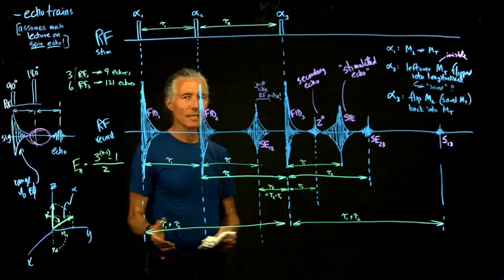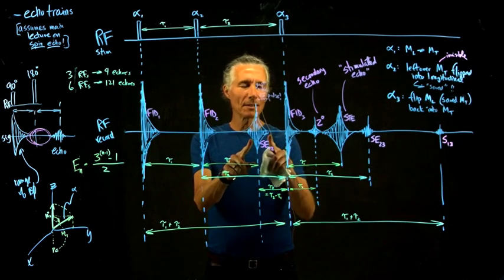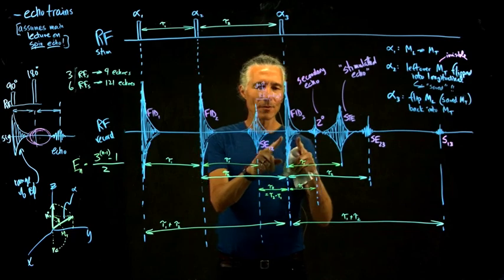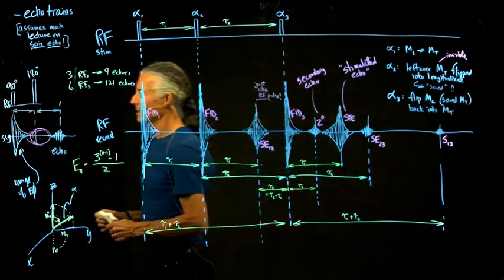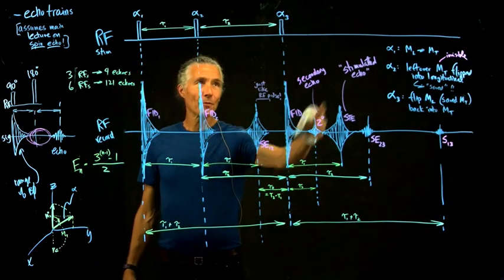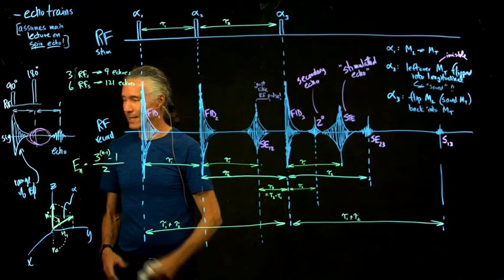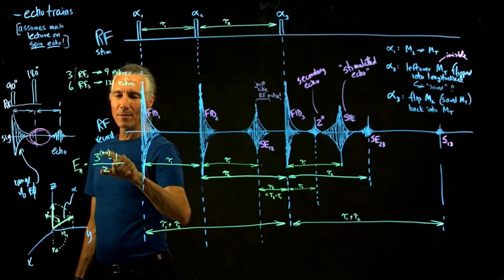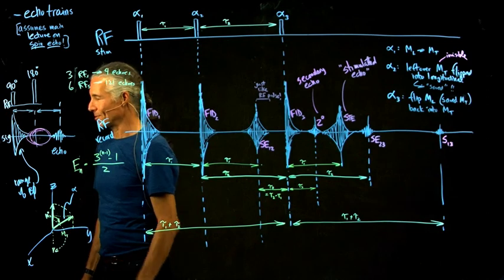But basically, with 2 RF pulses, we just get 1 spin echo, everything dies out. But there's a whole bunch of hidden magnetization still there. So if we do a 3rd RF pulse, suddenly these 4 additional echoes appear. And if we did a 4th pulse, we'd get another pile of echoes past that. 3 to the 3 is 27, minus 1 is 26, over 2. We get 13 echoes.